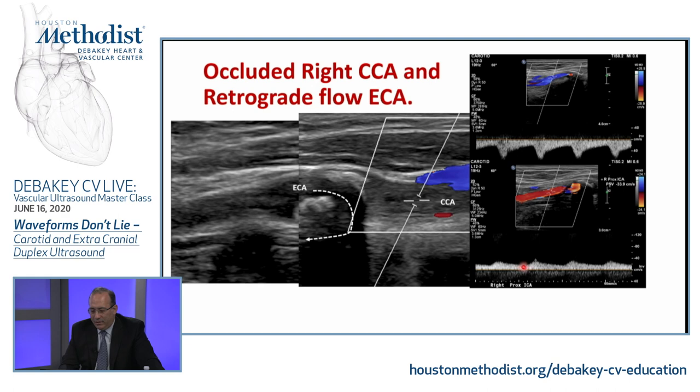But look at that internal carotid artery. The flow is low resistance, but there is some dampened peak systolic flow. So that tells you that there's a stenosis still at that origin. So maybe as you see the external and the internal carotid, right at that origin of those two vessels, there might be a stenosis. And that's why the peak velocities here are dampened.